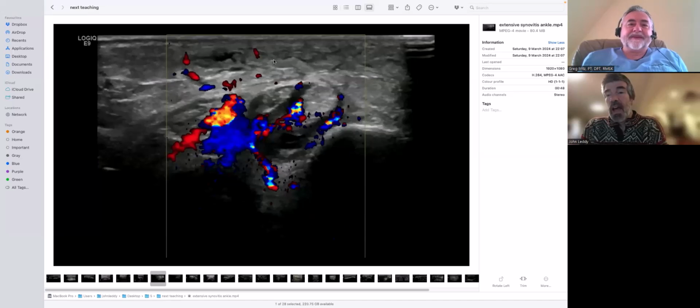Okay. And you just lean in because sometimes that's what you need to get your picture. And the same sometimes with Morton's neuromas. When I'm scanning from the plantar surface, my hand is by my side, my elbow is by my side, and I use my body weight just to press in, and with my other hand just pulling back above the metatarsals just to make space. And sometimes on a big foot, that's what you need to get the picture. And then lighten up a bit.